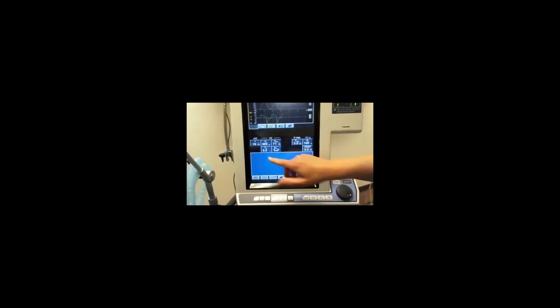Okay, so this IE ratio 1:1 is almost an inverse ratio. So when you change to 1:3, I wanted it to go 1 to 3. I would do a faster inspiration, so you have to go up on this one. Yeah, it's right. And now go down on the rate. Yeah, because we had it, oh, actually, we had it with 18. Because these are stiff lungs, it's very difficult.